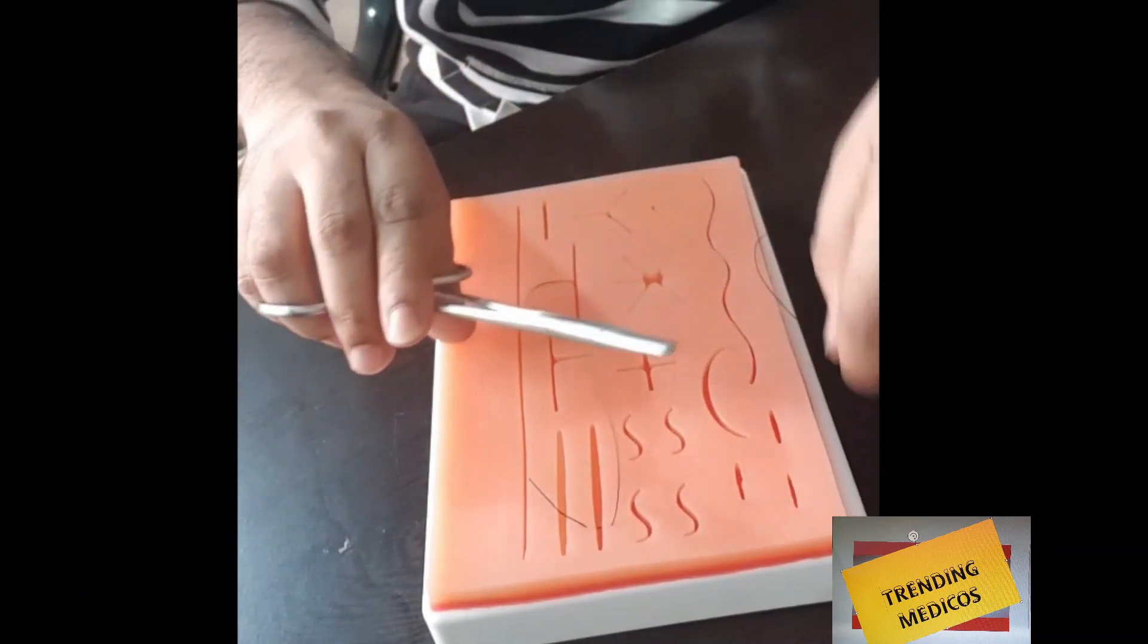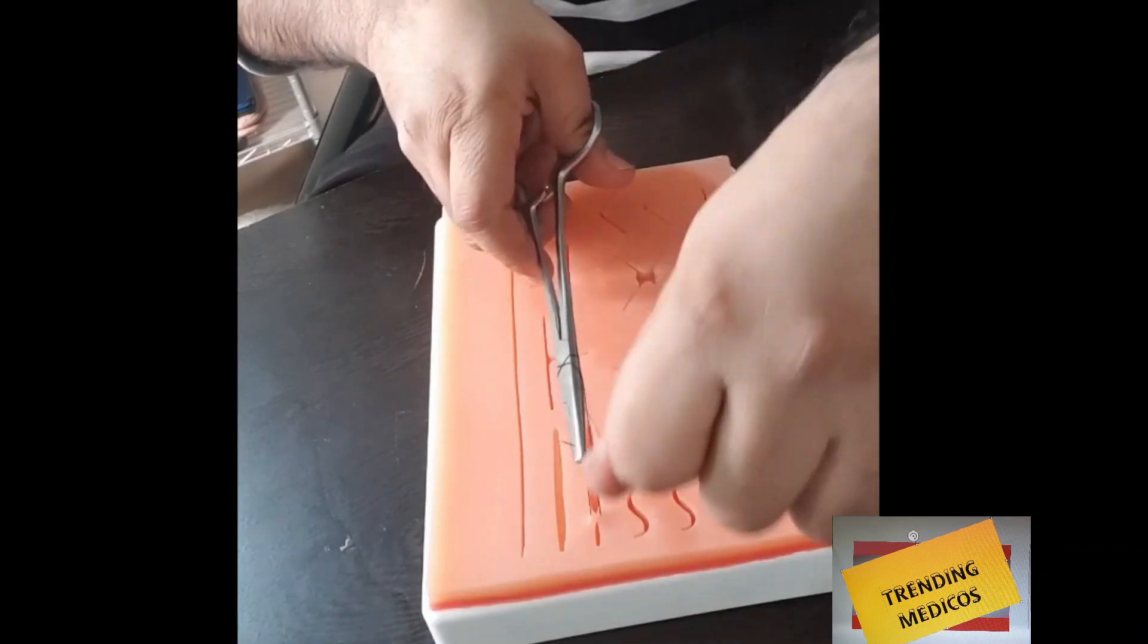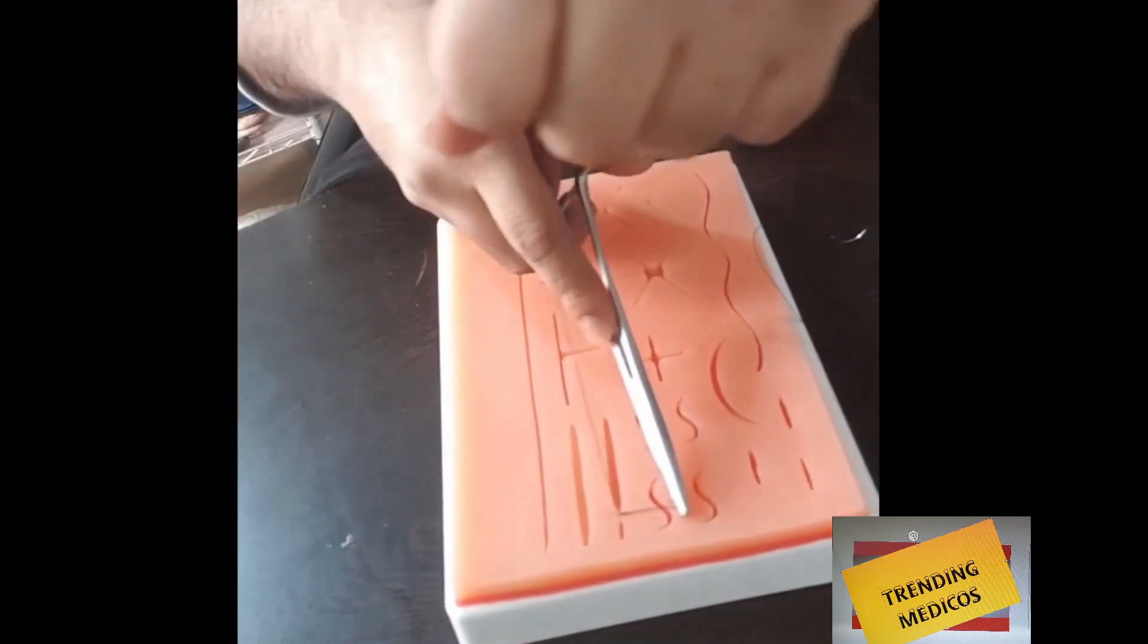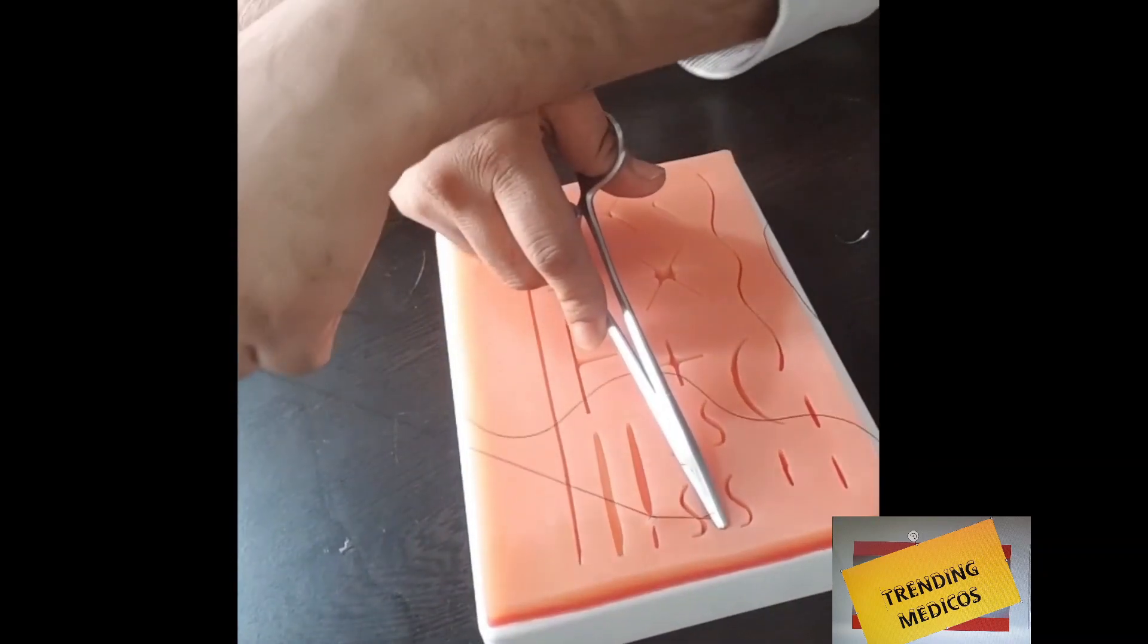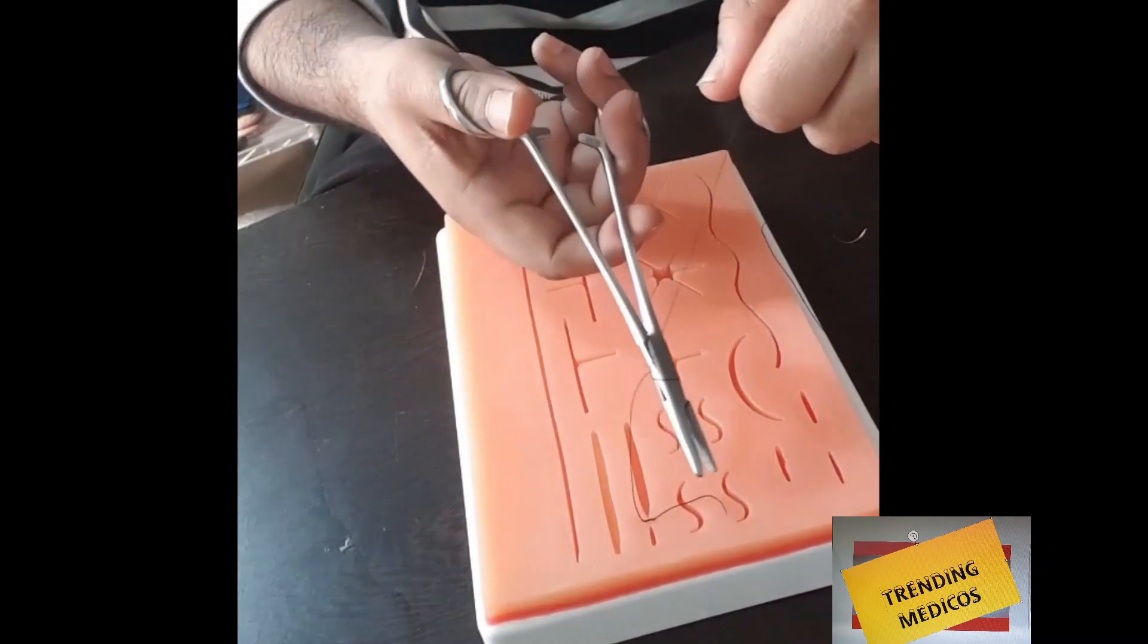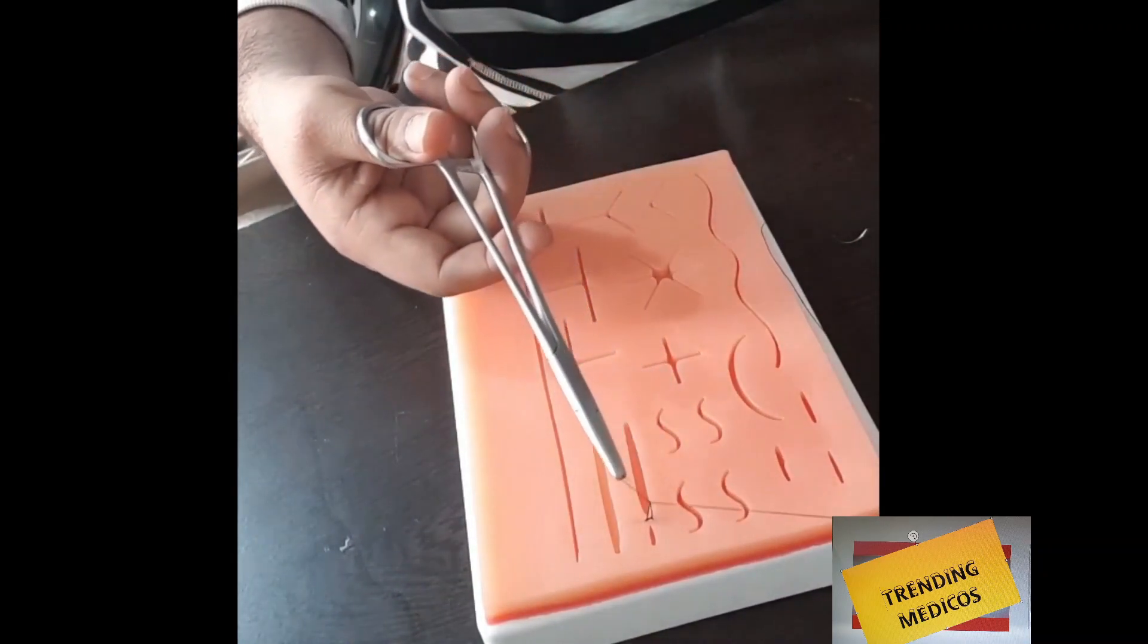Take a loop inside the C shape, then cross. Again, make a loop inside the reverse C, hold the smaller end of the suture, then cross again.